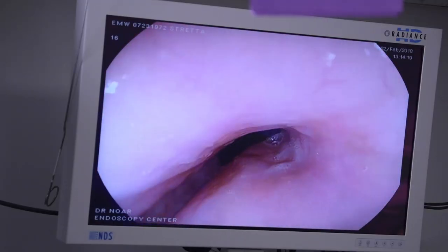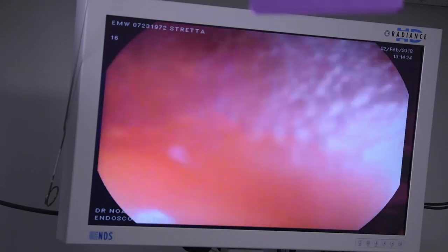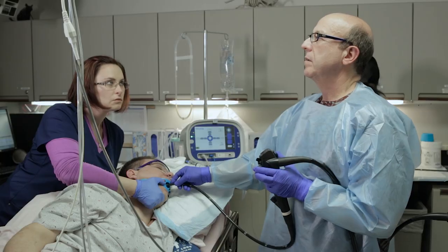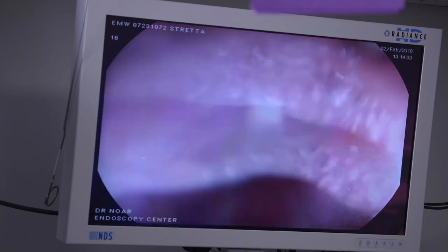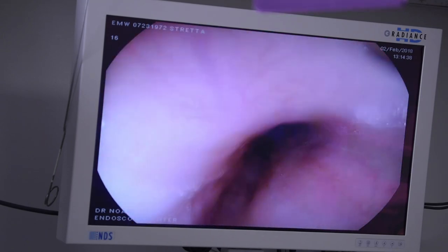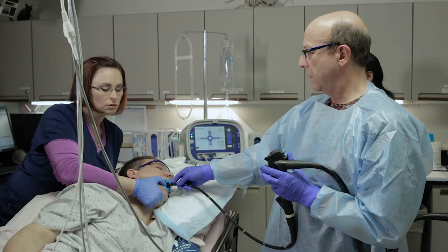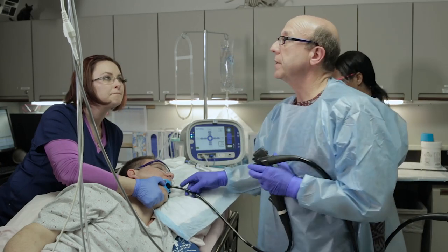We'll do that each of three times because the esophagus does change — it elongates or shortens — and we want to make sure when we place our catheter we're always in the same place. Each time we're just going to keep the air flowing, and this will duplicate what we're going to do with our catheter. It looks like 42 centimeters will be our distance.